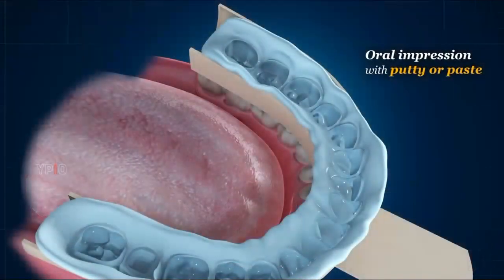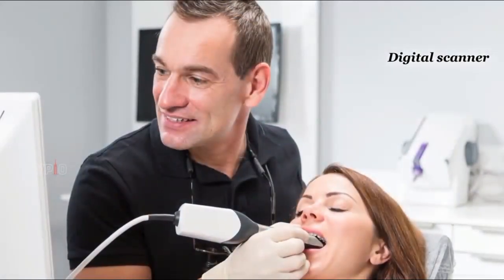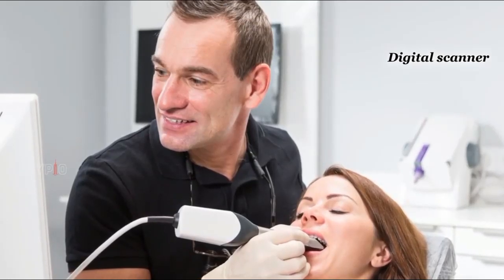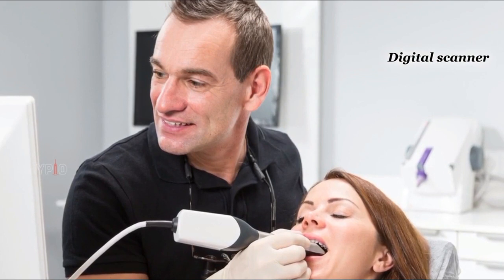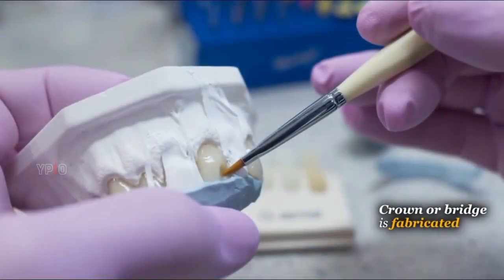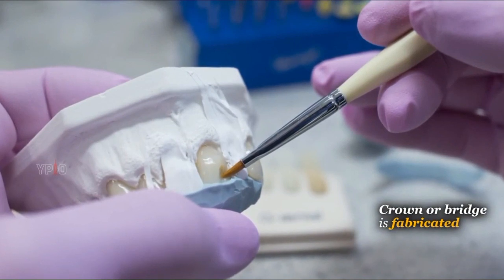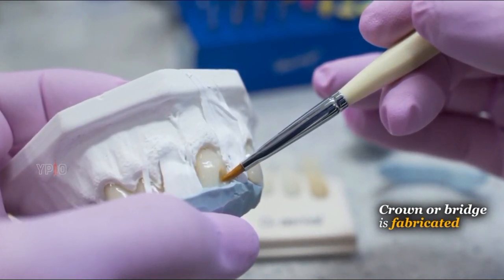After the teeth are prepared, your dentist will obtain an oral impression with putty or paste, or use a digital scanner to produce a three-dimensional record of your prepared teeth and soft tissues. The impression or scan along with the selected shade are sent to a laboratory where the crown or bridge is fabricated. This usually takes about two to three weeks.